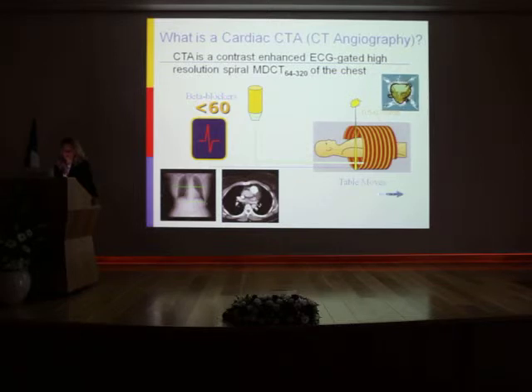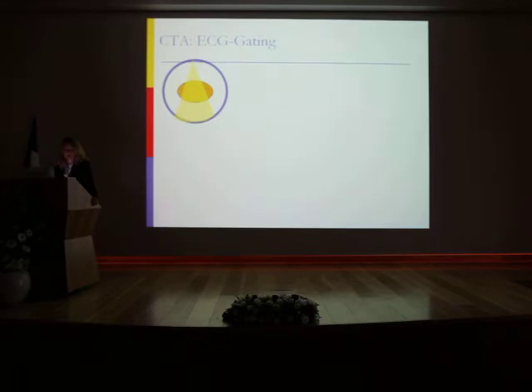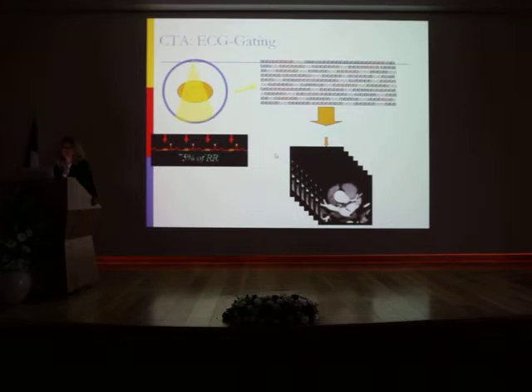When the aorta is full of contrast, we ask the patient to hold his breath, and acquisition starts. It's mainly on 64 slices, taking quite a few seconds, like 5 to 10 seconds. We take only those pictures that were acquired during mid-diastole, because this is the time where there is less motion artifacts, and this will be the reconstruction we will analyze first.